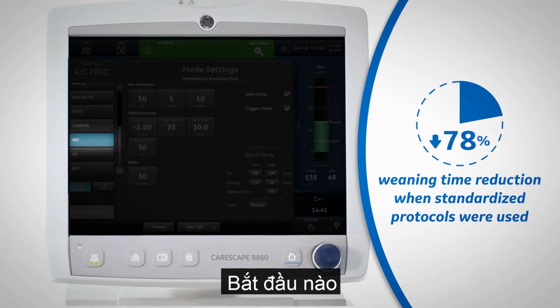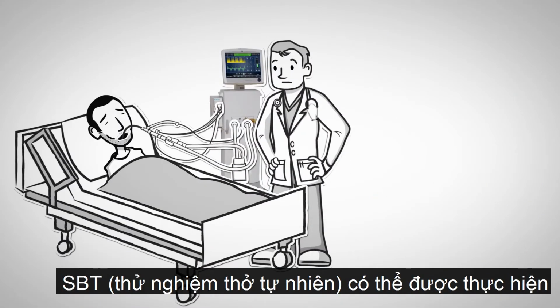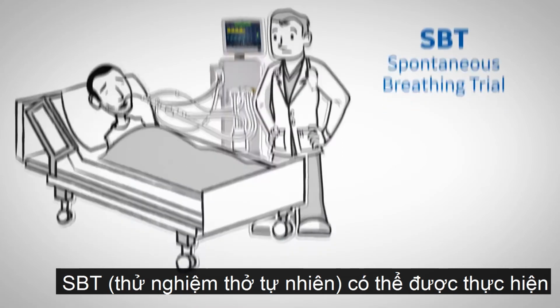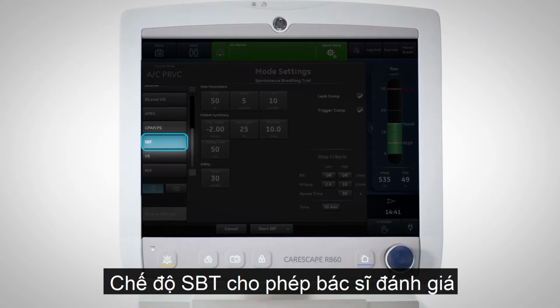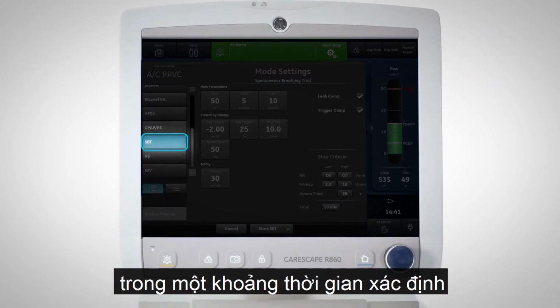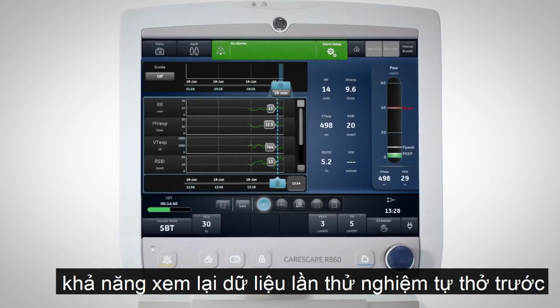Let's get started. When a decision is made to begin weaning a patient from a ventilator, an SBT, or spontaneous breathing trial, may be performed. SBT mode allows clinicians to evaluate a patient's ability to breathe spontaneously during a specified duration of time. Trending information gives the clinician the ability to review past spontaneous trial data.